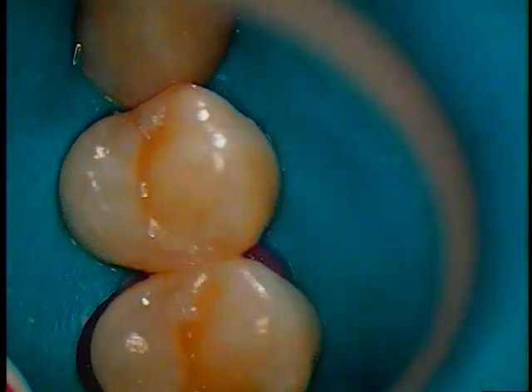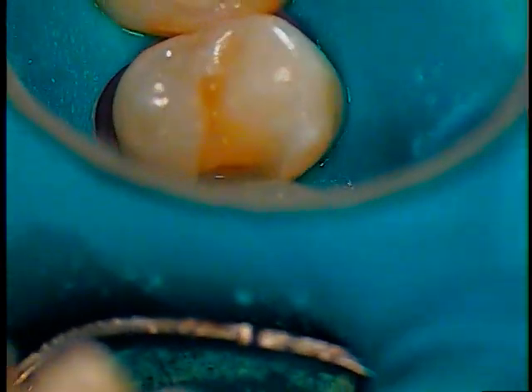Okay, so now I'm getting rid of the brown stuff. Let's take a closer look so you know what that looks like. Move the patient down a little bit. Okay, put him back in focus.